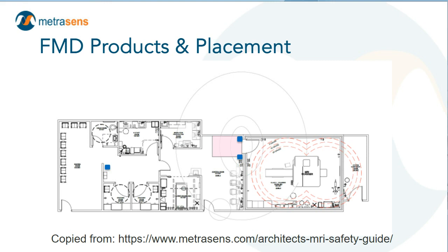So if we have a ferromagnetic detector here, we can provide ferromagnetic screening for patients or staff or visitors or whomever wouldn't normally come in through the route where we have the screener for patient screening functions. Depending on your use, depending on what you're looking for, there are different ferromagnetic detection products, and there are different ways to locate them so that they serve the needs most effectively.